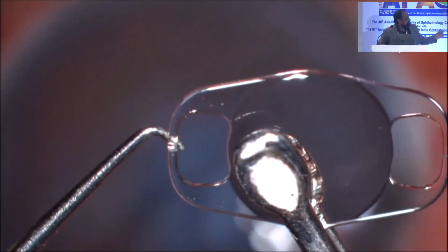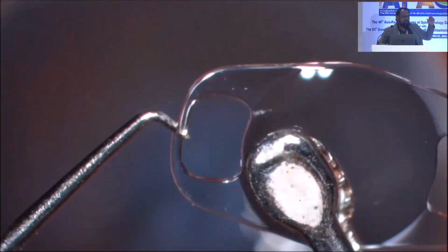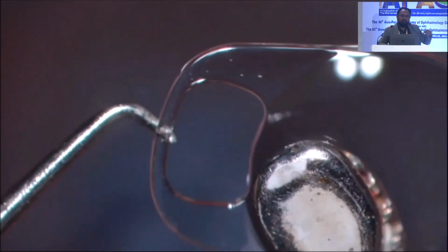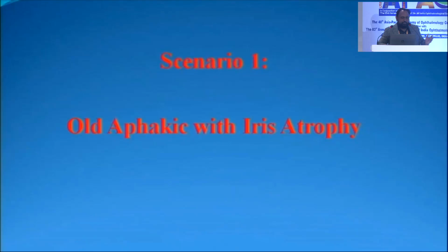Also always check the claw, because sometimes the area is not fully cut through. I have had many incidences where you've gone inside and you're attempting it multiple times, and that can cause damage to the iris. So just check the lens and make sure where you're going to clip before you put it into the eye. So we'll go through the first case scenario.